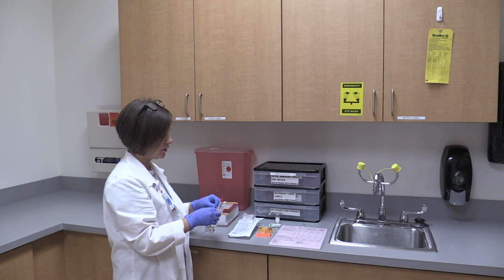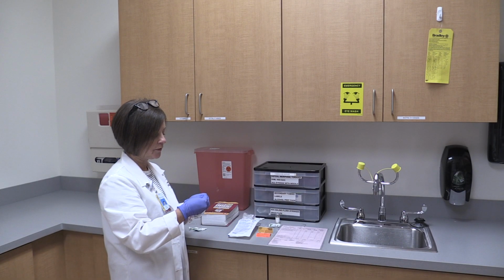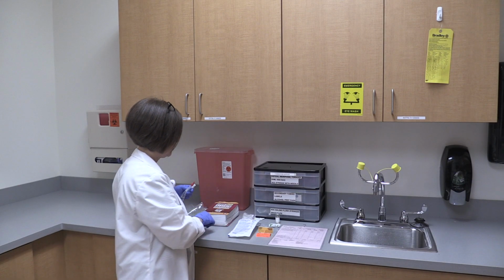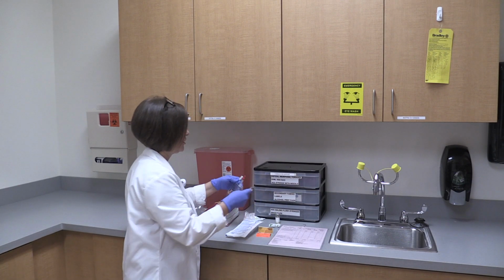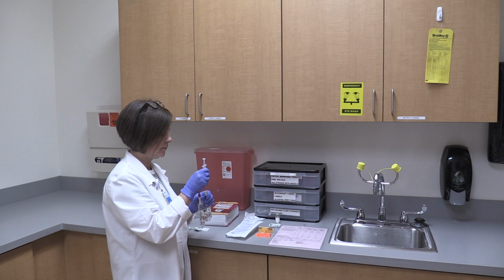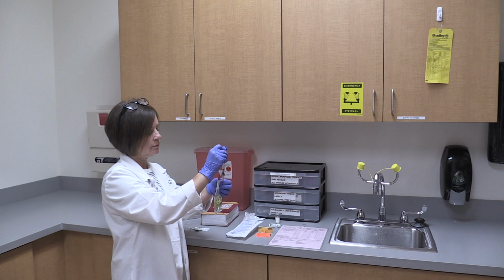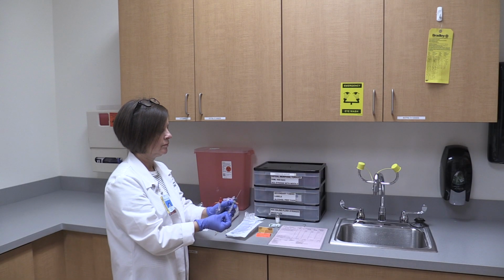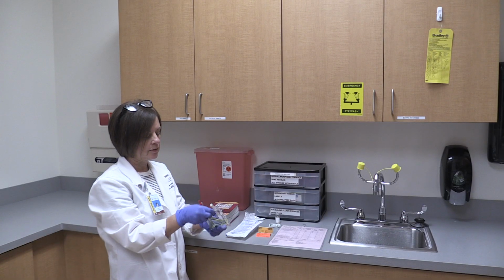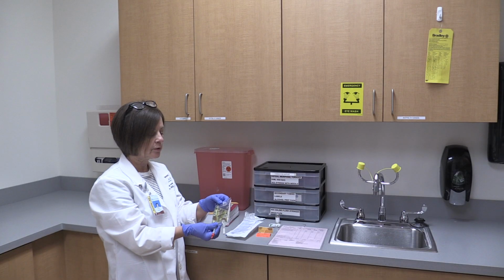I'm going to take another alcohol swab, clean off the port for 15 to 30 seconds, and then take my medication and insert it into the bag. Throw my needle in the sharps, and I'm going to gently mix the medication. I don't want to shake it, just want to kind of roll it back and forth.